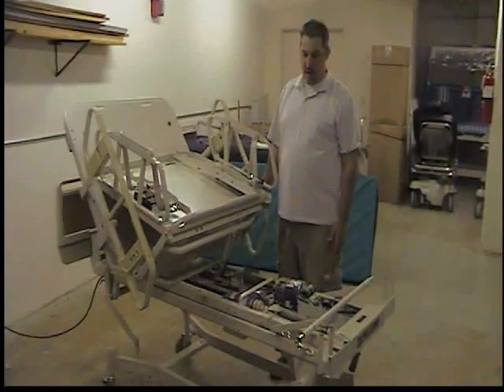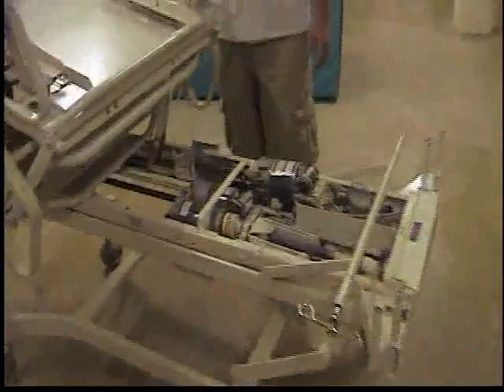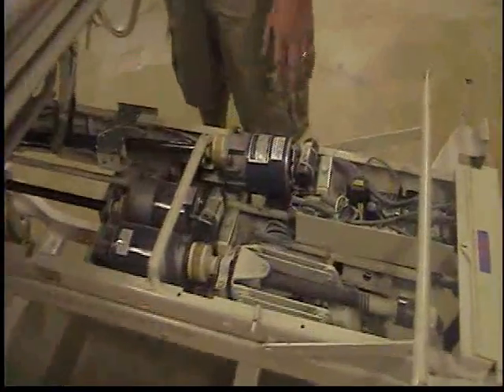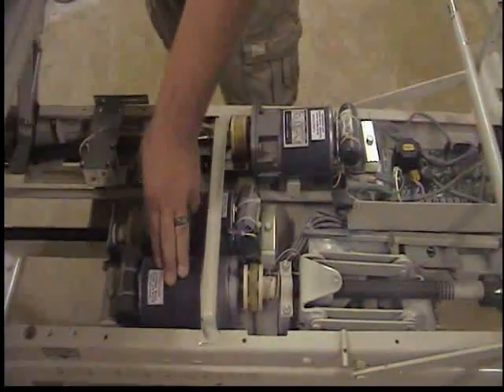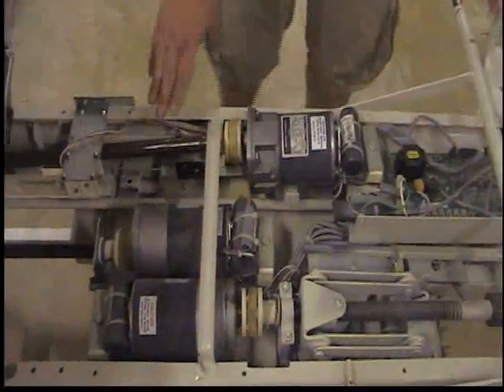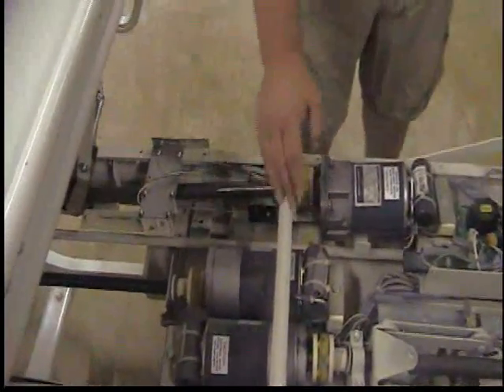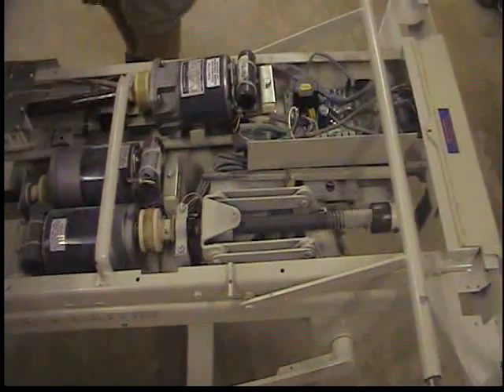Here we are with the bed open now, so we can check the inside components. We have our foot motor, our head motor, and our high and low limit motors. Each have the drive shafts — for the foot motor, for the head motor, and for the high and low. You want to make sure they are lubricated. First we will just do the high and low limits — you can see how the drive shaft works there.